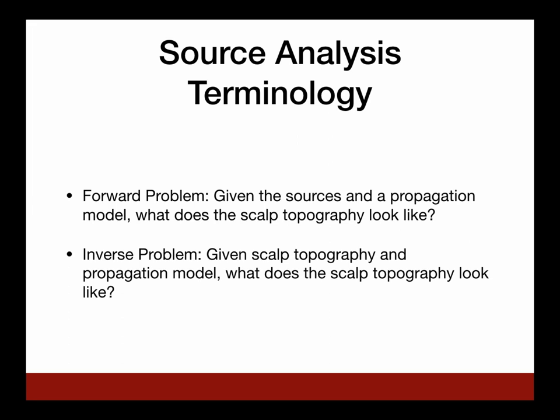It turns out that the forward problem is difficult enough because you can model what the head might look like and propagation models of the head by buying, say, human skulls and filling them with jello. This has actually been done. And then putting little electrodes in to inject current into them and seeing how the current flows throughout that jello mold through the skull and possibly scalp.